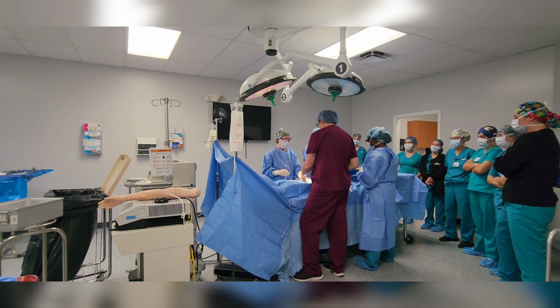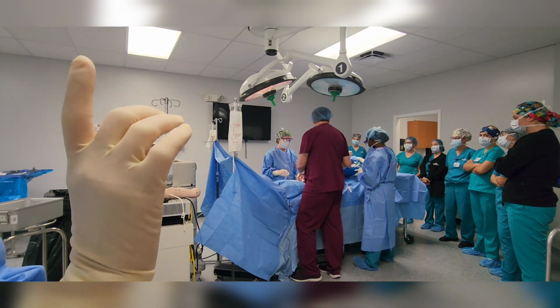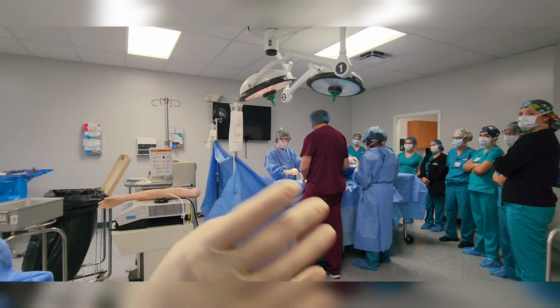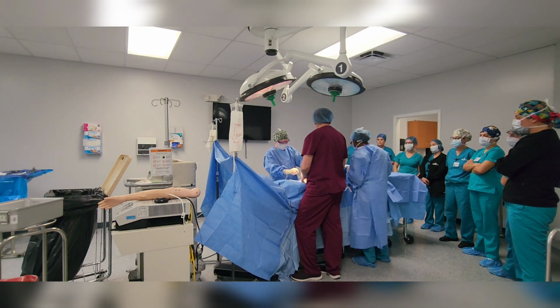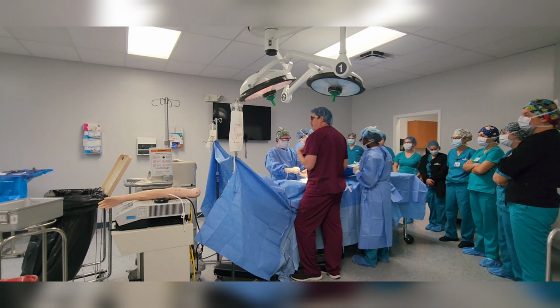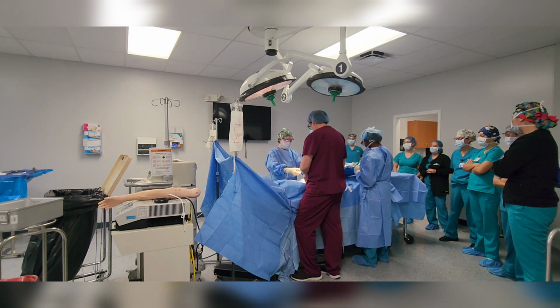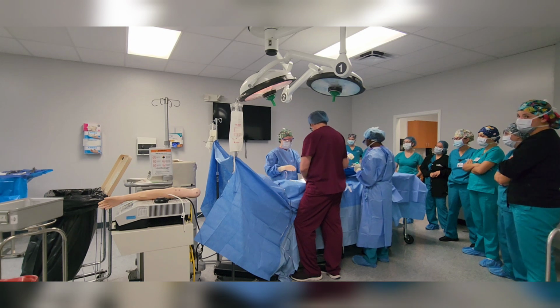Fine. So hold that just like that. Can I get a Babcock? Take that out with that hand. Hold that. Can I get a Coker? I want to hear "Coming your way, doctor." Coming your way, doctor. There you go. Because otherwise, I'm like, am I the only one working here? Yes, you are, Doctor. That's why you're here. Put that up. Can I get a mosquito, hemostat, cryo, something like that, curved?